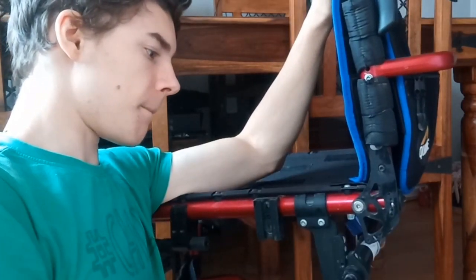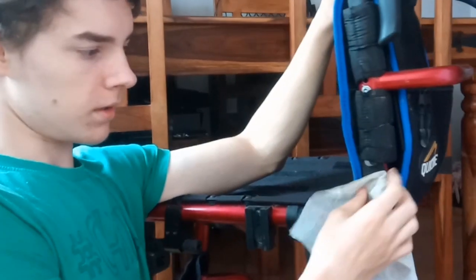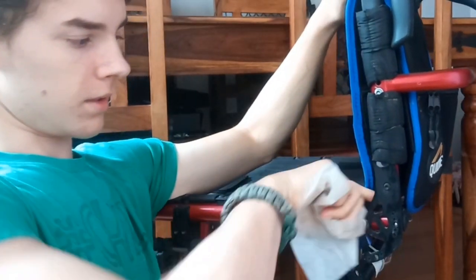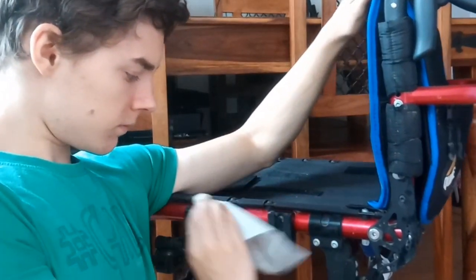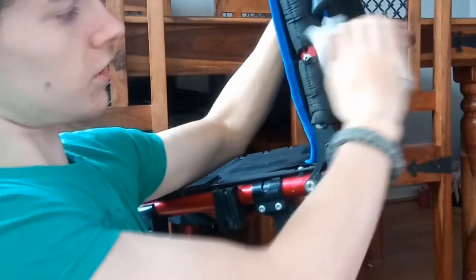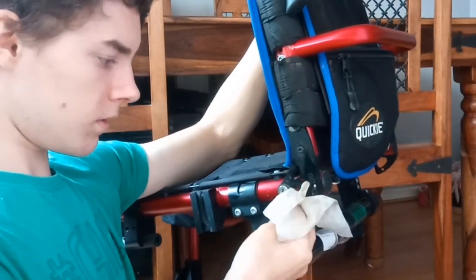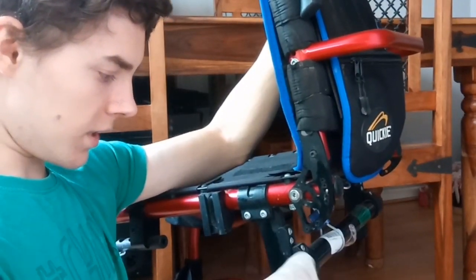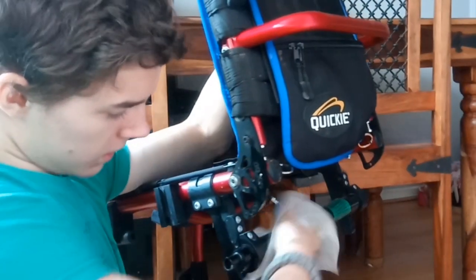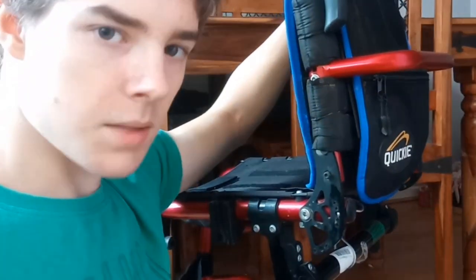So, I don't think I can really get behind here. I don't know if you guys can see that, but in there, I can't quite get. So, yeah, I think that's pretty much everything that I can do. So yeah, what I'm going to do is reattach the wheels, and yeah, we'll get on to the next bit.